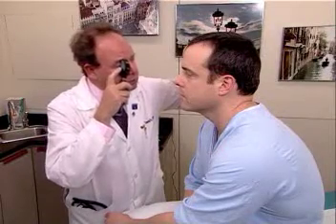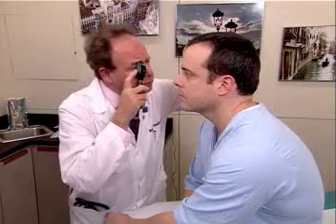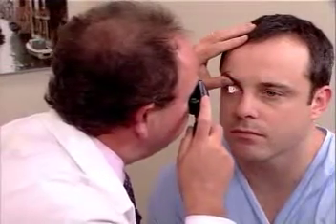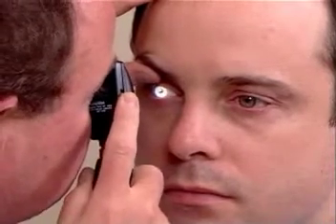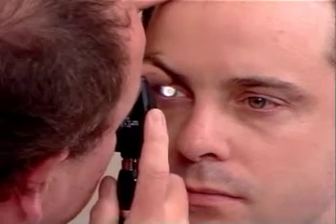As you move closer to the patient, you will turn the lenses to focus deeper as one gets into the eye, past the lens, through the vitreous, and then into the retina. You must always be at eye level with the patient. First visualize superior nasal, inferior nasal, inferior temporal, and superior temporal.